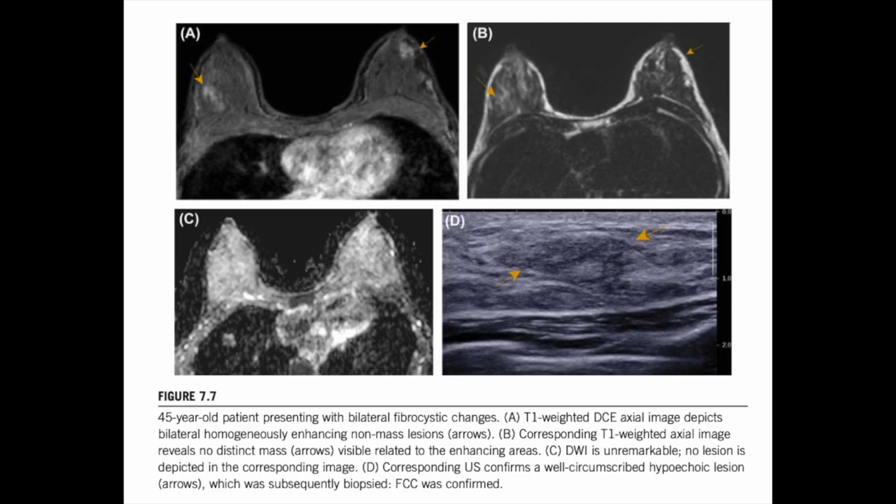Okay, so crowded cells. How does that affect water? Think of a subway car at rush hour. The water molecules are the people. In an aggressive cancer, the cells are packed so tightly, what we call high cellularity, that the water is physically restricted. It can't move. It's stuck shoulder to shoulder. Exactly. And that restriction is what makes the ADC value go down.